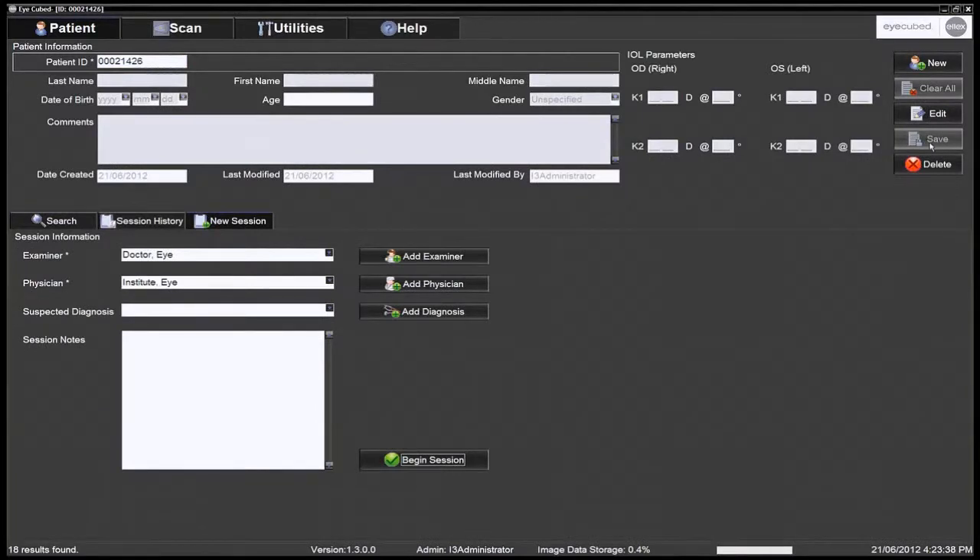Check that the patient information is complete on the summary screen. To begin an examination session, you must select the examiner as well as the physician ordering the exam. At times, the examiner and physician will be the same. A default examiner and physician may also be selected.